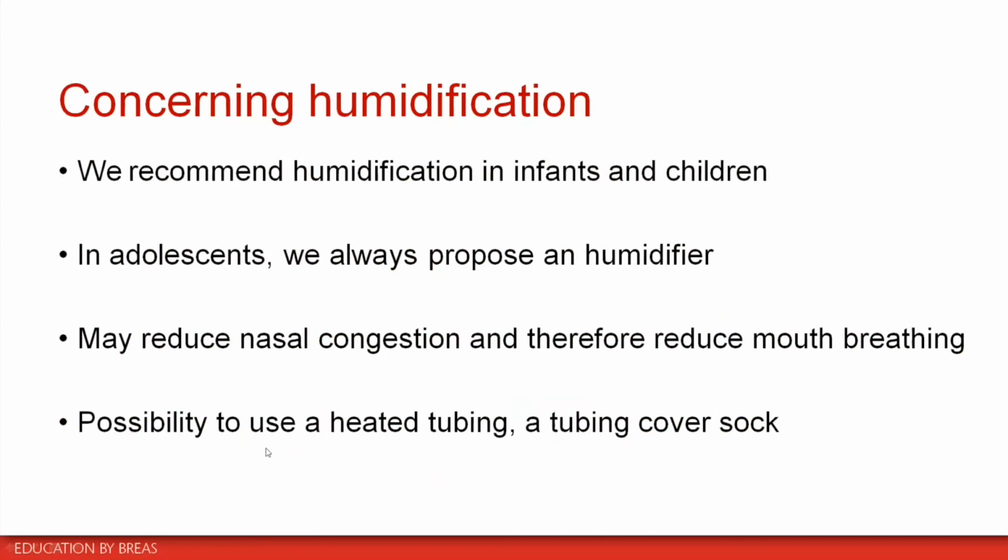What is very tricky with humidification is that sometimes it will be too low, but if you increase the humidification, you will have some water within the tubing. And this is a big problem because the water within the tubing can arrive until the mask, and so until the nose and the mouth, and that's not a very good thing. So you can't increase the humidification too much because of the water condensation within the tubings, and so you don't have a solution.